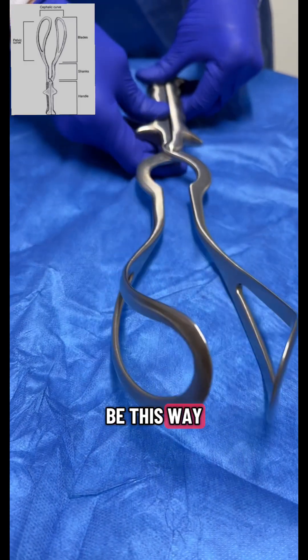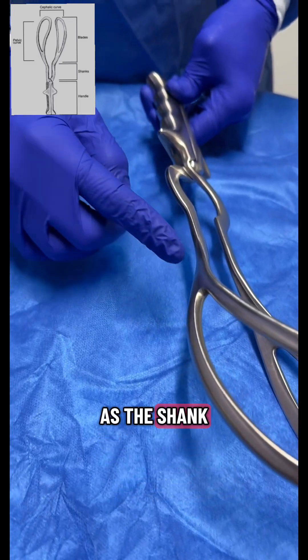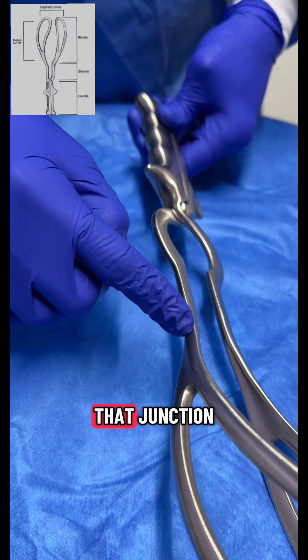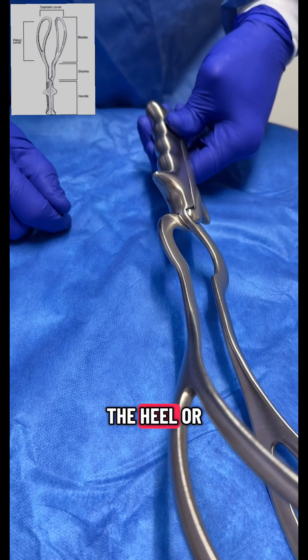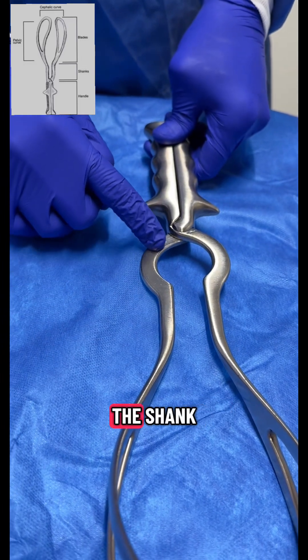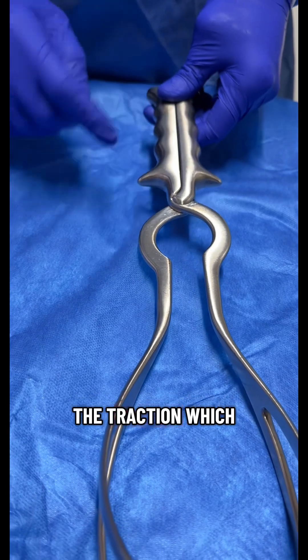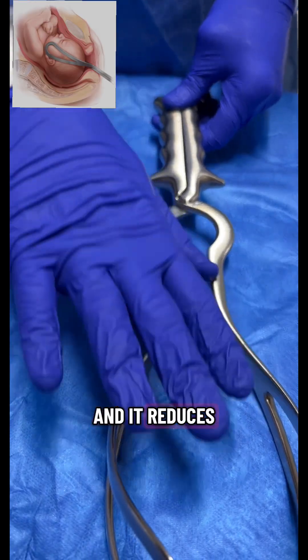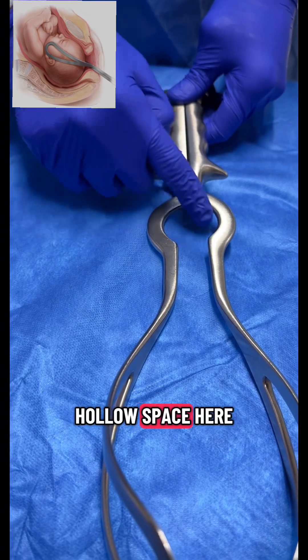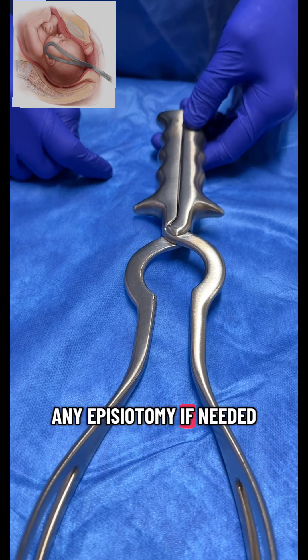The second part of the forcep is known as the shank. The shank starts where the blade ends, and that junction is known as the heel or neck of the shank. The shank reduces the overall weight and the traction from the blade, thereby reducing pressure on the baby's head. The shank has a hollow space that allows visualization of the perineum and to give an episiotomy if needed.